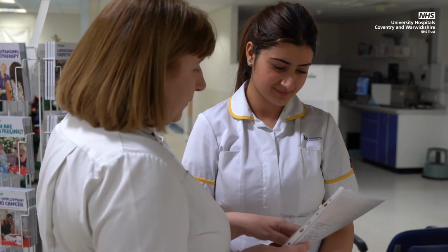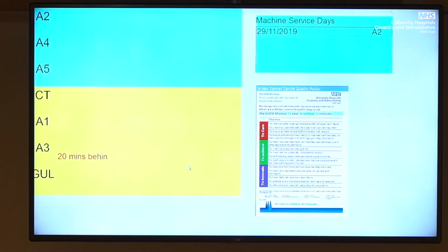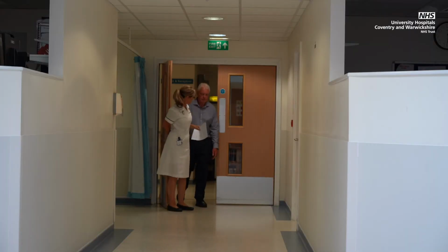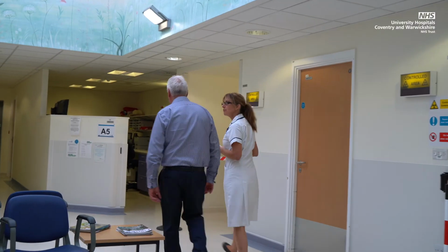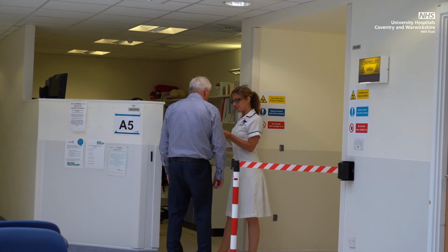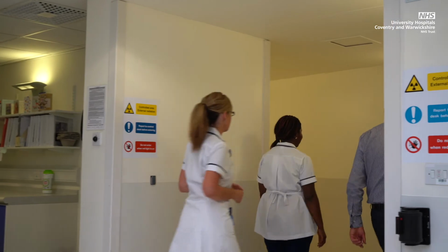As we are a teaching hospital, we have student radiographers who work in radiotherapy and are supervised by qualified and experienced radiographers. There are TV screens in the waiting room which will inform you of any delays on your treatment machine. If in doubt, ask at reception. When we are ready, a radiographer will come and collect you from the waiting room. Before going into the treatment room, the radiographer will talk to you about what to expect. Here, they will ask you to confirm your name, date of birth and address. This will be asked every day before treatment as it is hospital policy. Once all the required information is given to you, the radiographer will take you to the treatment room.